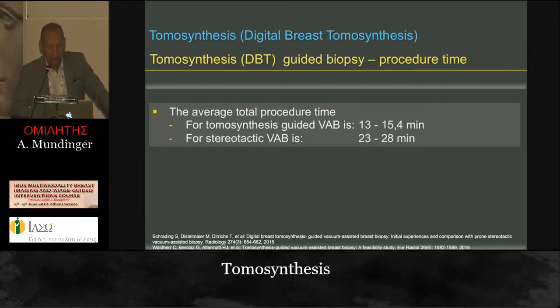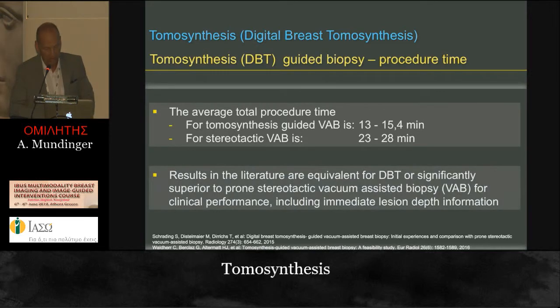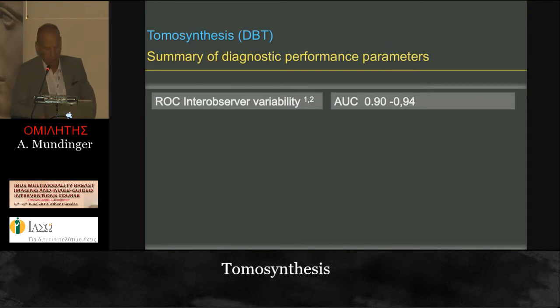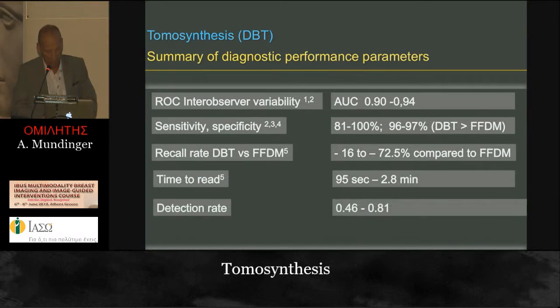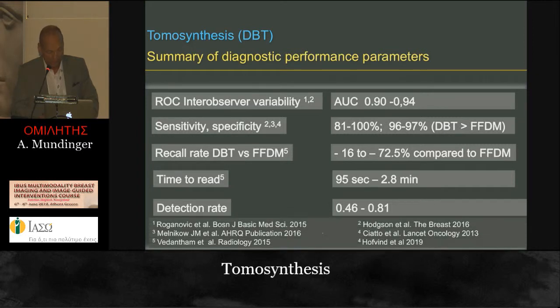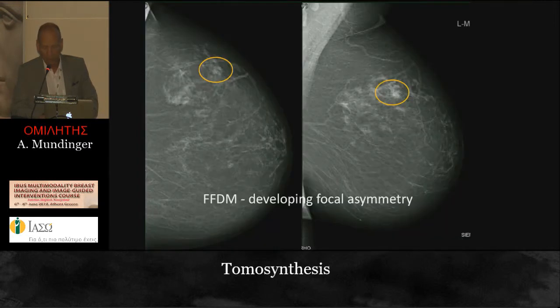The advantage of the DBT guided biopsy is that there is a shorter procedure time compared to the stereotactic procedure, and the results are equivalent. So this is a very interesting new approach. And if we look at the performance parameters, this is a summary, and the general message is it's better than digital mammography, particularly with respect to the detection rate. So high variability depending on the time the studies have been performed and the systems they applied.